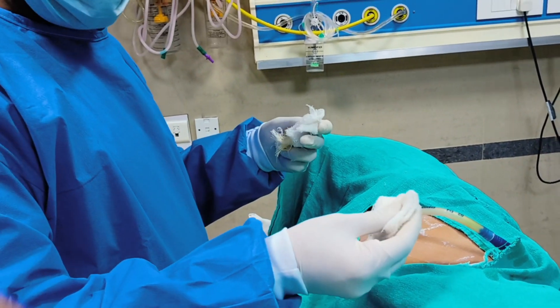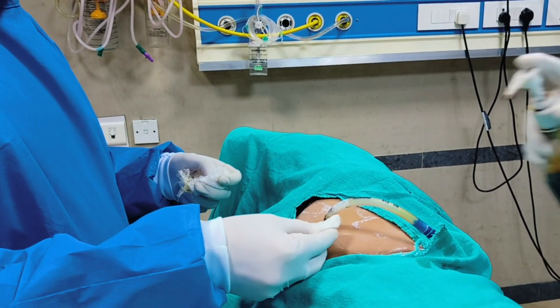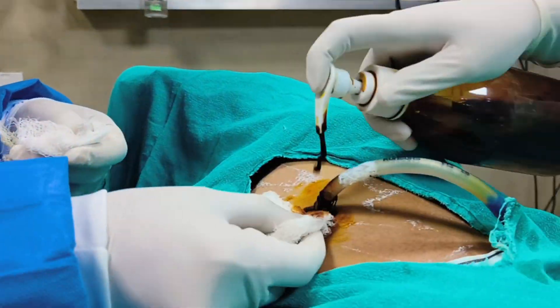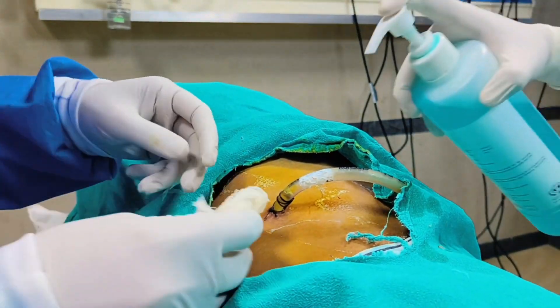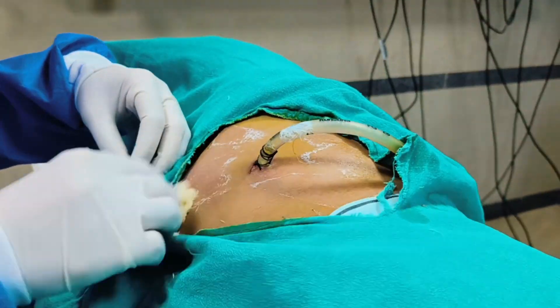We will clean it with 10% povidone iodine. We have to take care of infection strictly, so we have to maintain sterility. We will take one dry gauze piece and wipe it out, then clean by spreading. We have to take care of sterility.